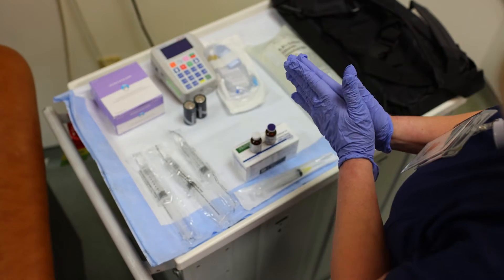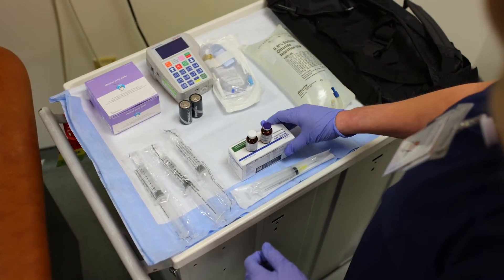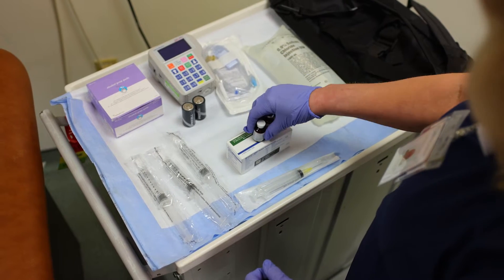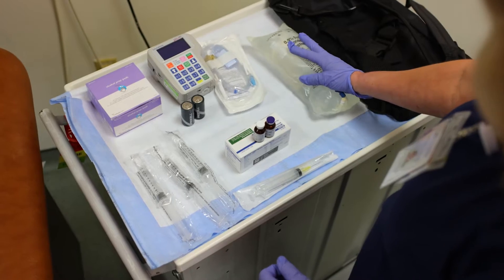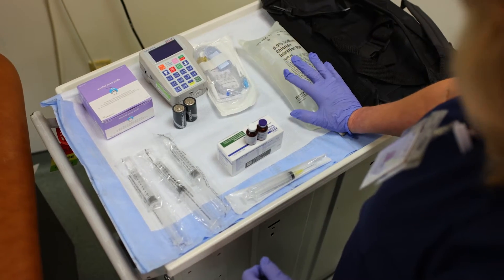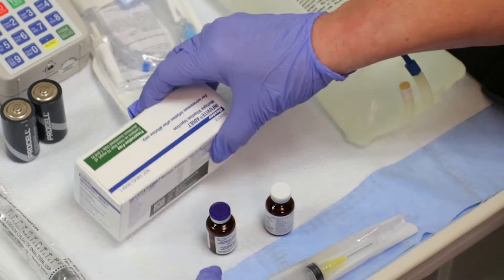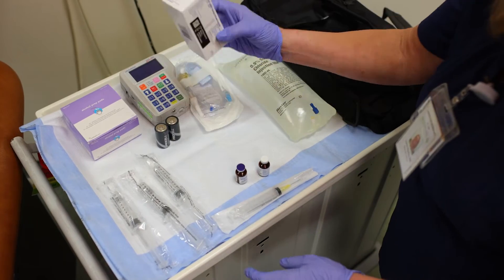I have washed my hands and put gloves on. The first thing we're going to do is get the vitamins out of the refrigerator and the TPN out of the refrigerator two hours before. We're going to get one blue and one white out of the box, then put that back in the refrigerator.